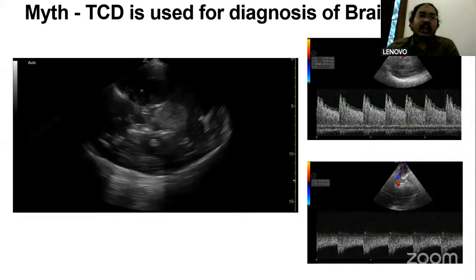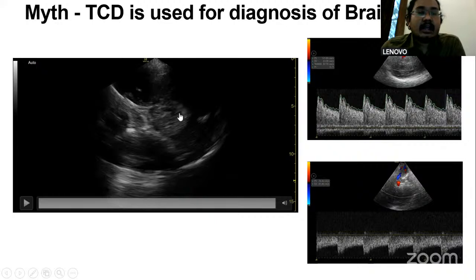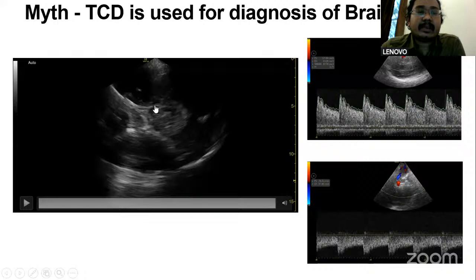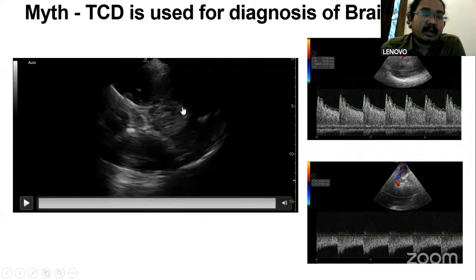So we have a case of pontine hemorrhage. Here in ultrasound you can see a nice pontine hemorrhage, like a hyperechoic structure. This is where the pons would be. Now this circular structure has replaced the beautiful butterfly shaped structure which was the midbrain. So the hemorrhage has spread all through the pons. Now on clinical examination, the patient did not exhibit any brainstem functions. So clinically, we have taken the patient to be brainstem dead. This is the patient's ultrasound picture.